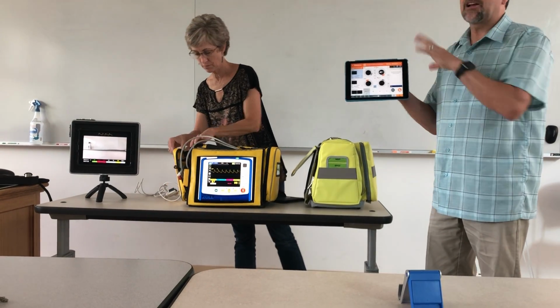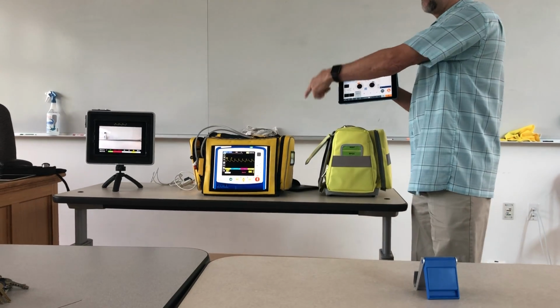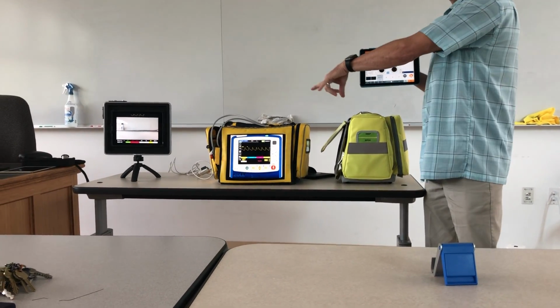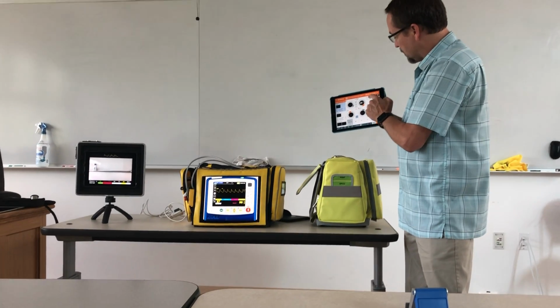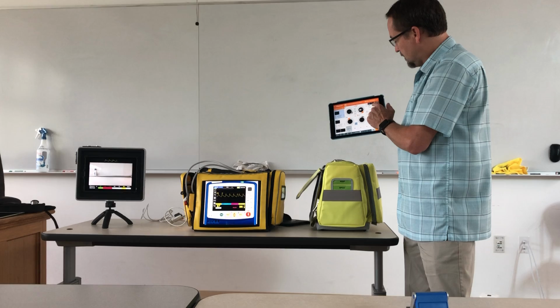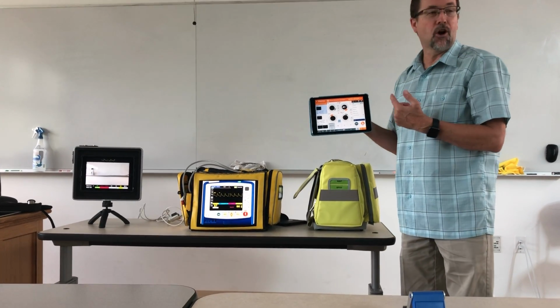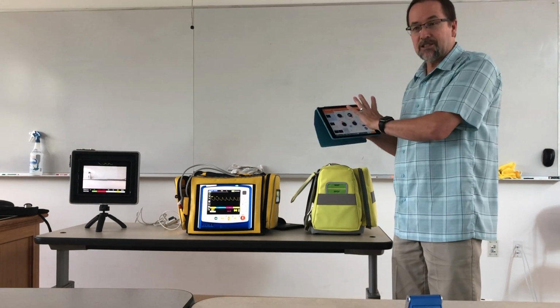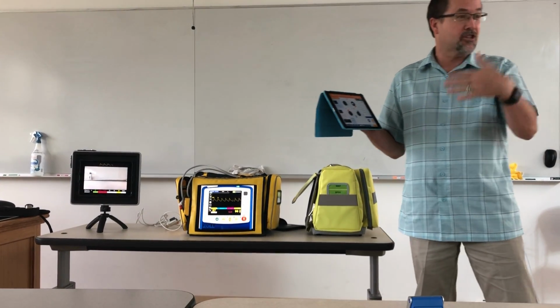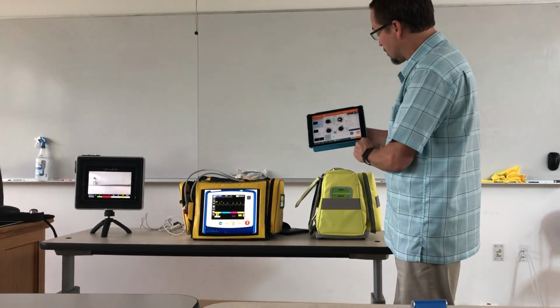The other thing that I like about this one versus the previous version, if you didn't want that annoying beep going on, you had to turn it off. You had to find the volume button on that iPad. Now they put a little sound controller, and you can either slide the volume down, you can turn off the heart rate, you can turn off the alarms, so you as the facilitator can decide whether or not you want to hear that, whether or not you want to give them an alert so that they notice that their patient just coded, whatever. So that's in your control as well.